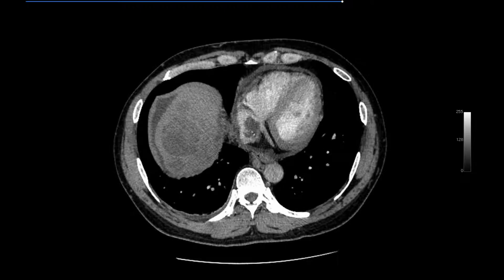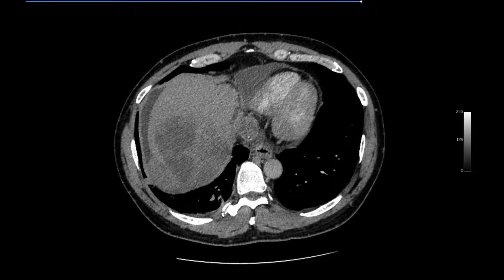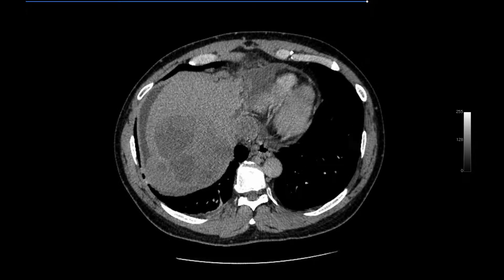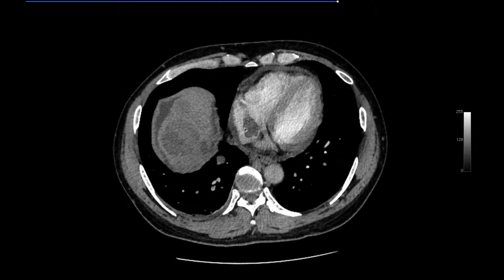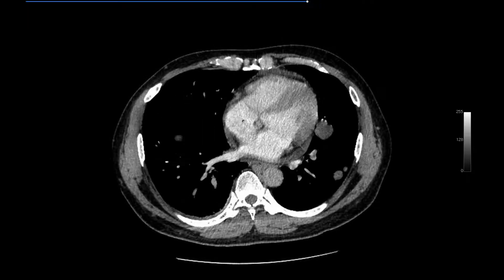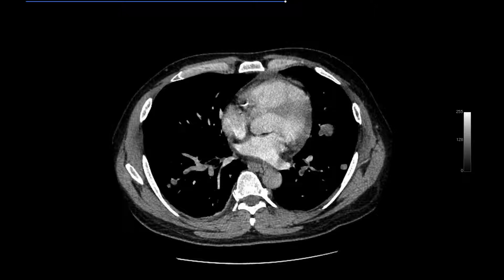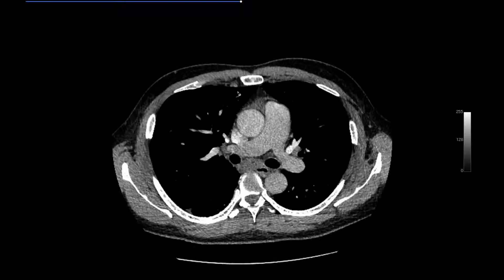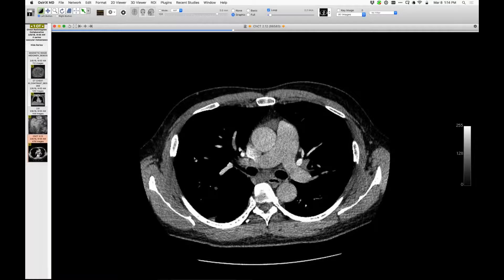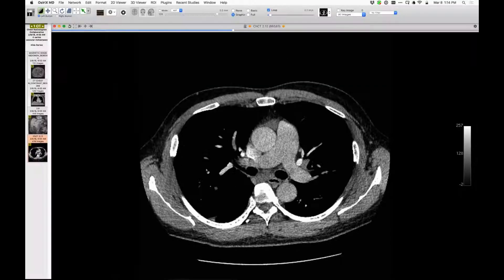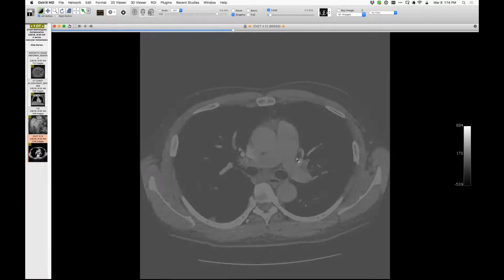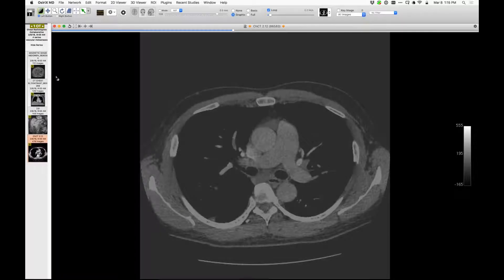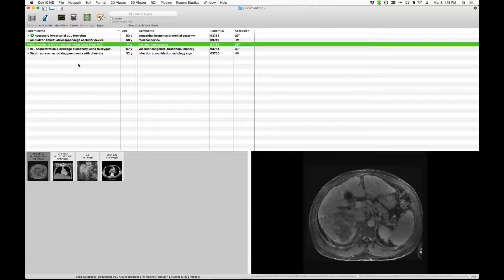In multiple locations are undoubtedly large intravascular tumor metastases growing in those vessels, as well as other nodules — pretty bad. So hepatocellular carcinoma with IVC involvement and extensive metastatic disease, particularly involving vessels of the lung. Especially those peripheral ones that are really expanding the vessels more than you would expect for bland emboli. I don't quite have a lung window to show you. I haven't quite figured out how to easily get these to display properly. So we'll leave it at that — and that's it for Julie's cases. Thanks to Julie for those.